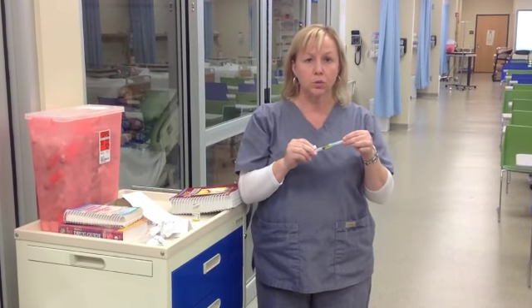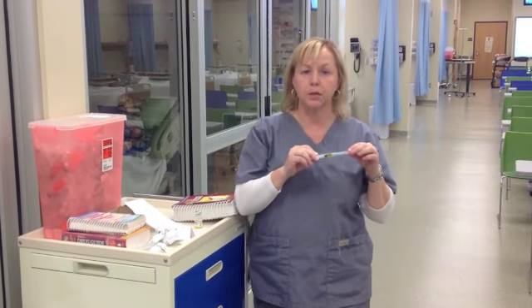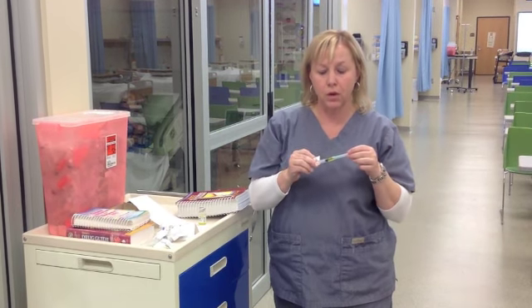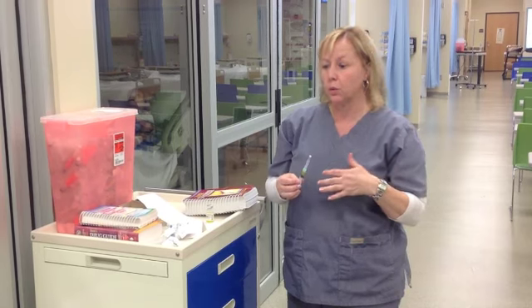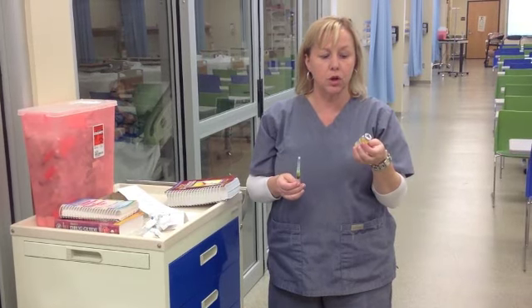Now we're going to do an IV push medication. Our doctor's order is to give 200 milligrams of Practi powder IV push to the patient stat. So what we're going to do is go ahead and do steps 1 and 2 like we did with the reconstitution and the drawing up. So we would reconstitute our Practi powder, and then we would calculate again how much to draw up.